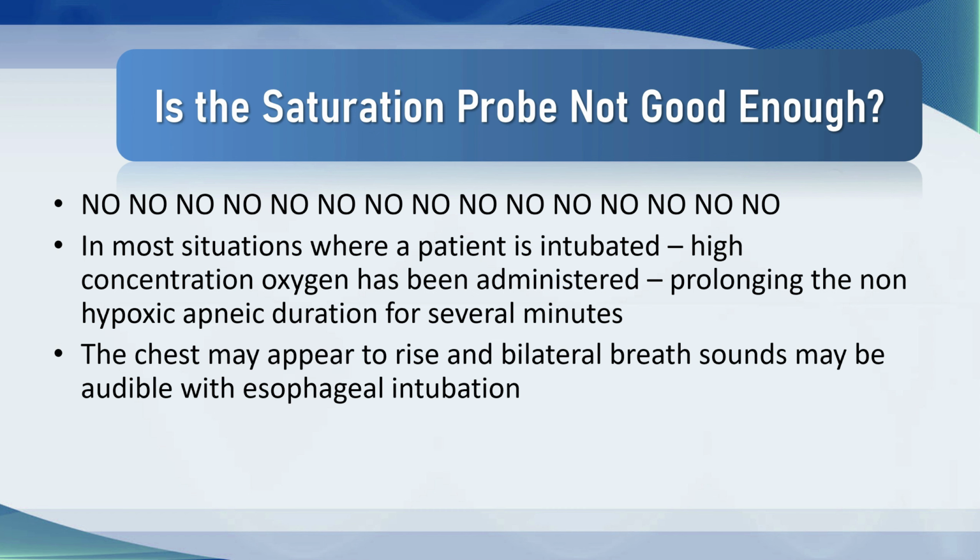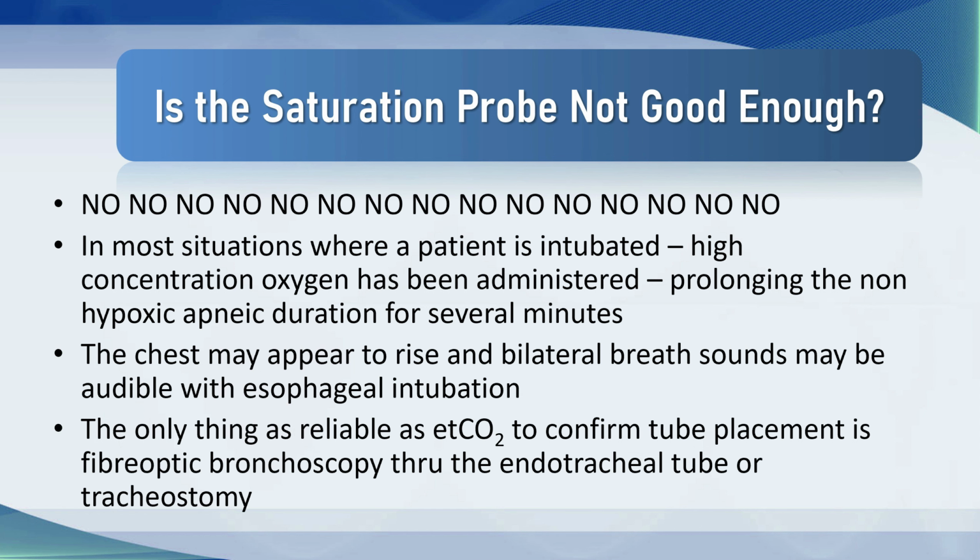And even if you get all that stuff of bilateral breath sounds and chest rising, it can be so misleading, because you can intubate the patient, the saturations look great, but the patient is getting progressively more hypoxemic. And what will happen is, down the line, 5 to 7 minutes later, the patient will suddenly become really hypoxemic and go into a pulseless electrical activity cardiac arrest, an asystolic arrest. So the only thing that is reliable is end-tidal CO2 to confirm tube placement.